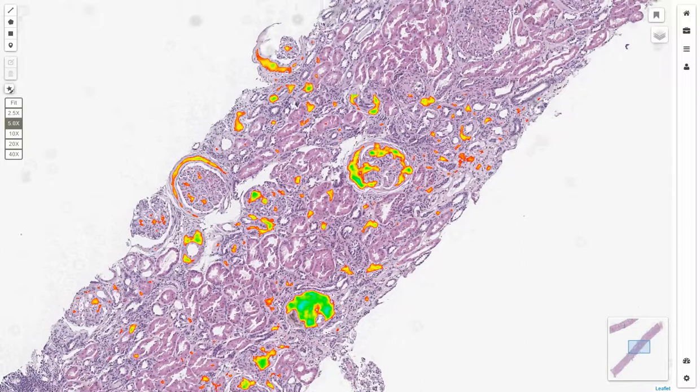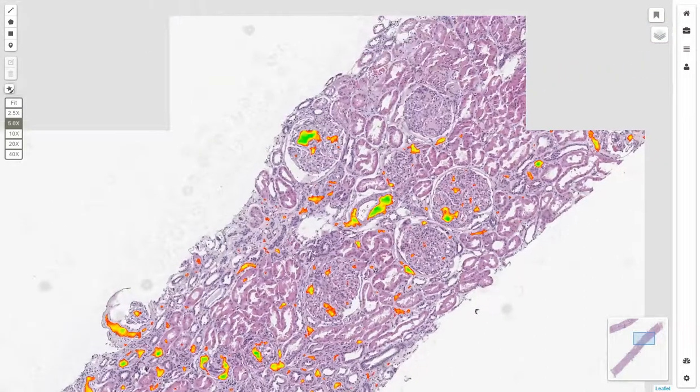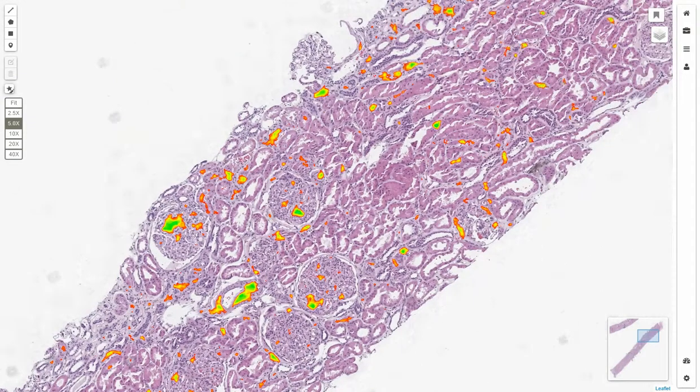And of course, this algorithm, which makes use of a set of GPUs in the cloud, literally carries out the segmentation in real time as the image is being perused and then transported across the web. So the transport layer sends both the tiled original whole slide images along with a heat map of the output of the VIPR algorithm. This concludes this demonstration of the VIPR algorithm as developed at the University of Michigan Division of Pathology Informatics in the Department of Pathology.